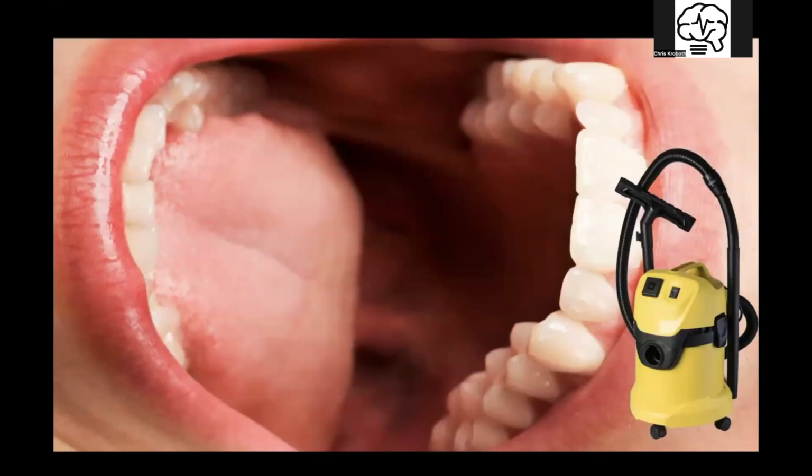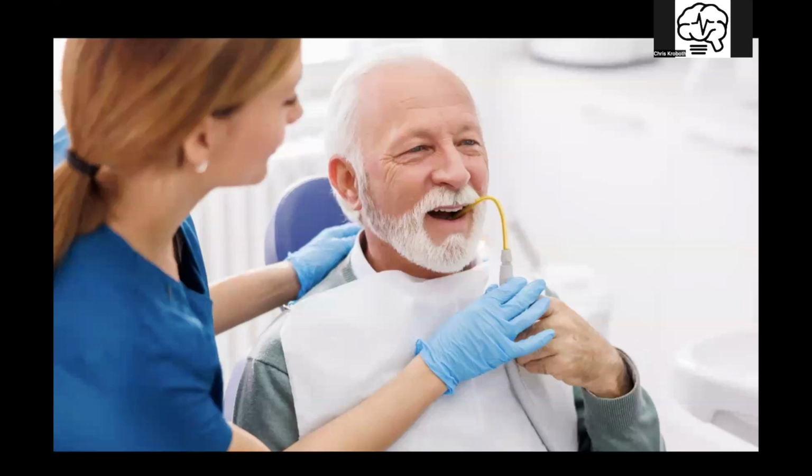So we need to suck it out, right? We're vacuuming it out. And that's essentially all we're doing, creating a negative pressure vacuum system and just sucking it out of there, just like you would the dust on the floor in your house.